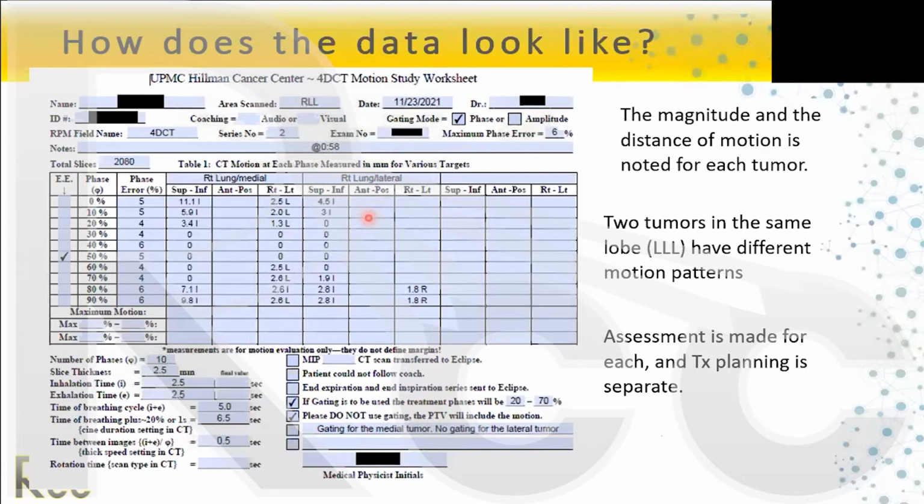The last sentences that you said, I didn't understand it well. Would you please repeat it again? I was okay when we are going to consider the 50% maximum exhale, because this is the most relaxing and clear without any artifacts in the tumor. So when we will consider the maximum inspiration, I didn't catch this.